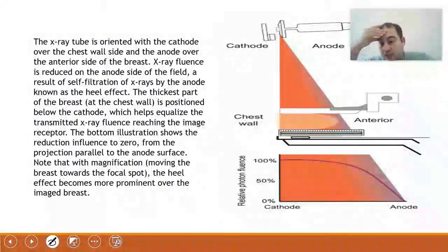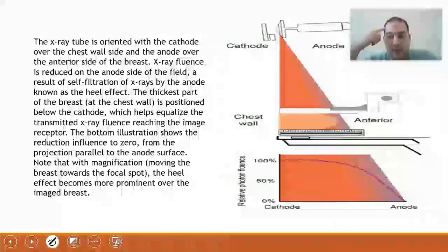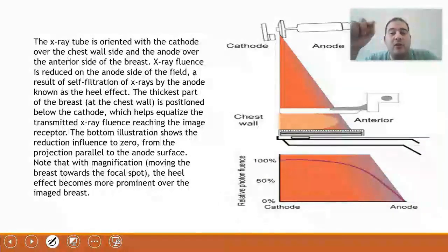Doctor, will there be a concentration used or the same targets available? No, doctor. If you look at the mammography device, you will find that it provides you with the available targets and the existing filters. You can choose the type of filter and the type of target you want. For example, there is a GE model that you are currently using in stereotactic procedures, for instance in biopsy cases. This has given me a lot of advantages, as you can choose the filter and the target you want from the screen.